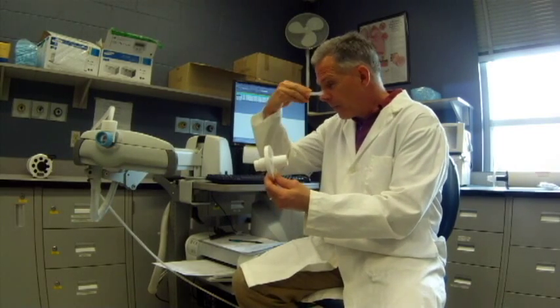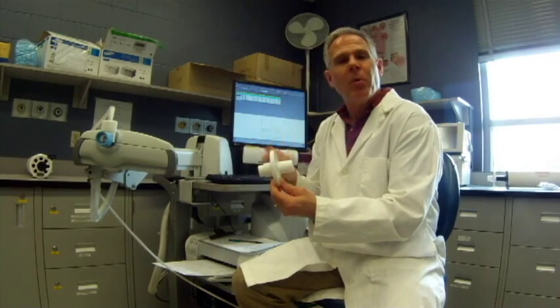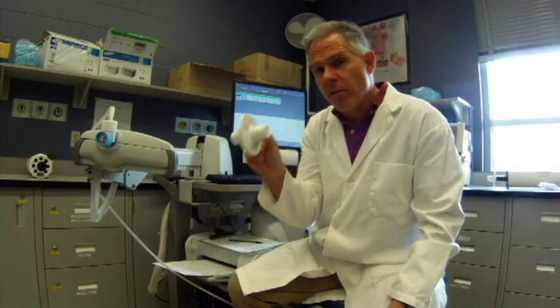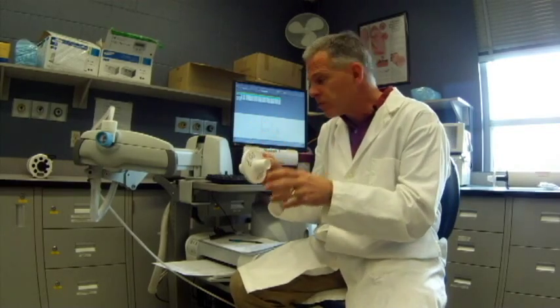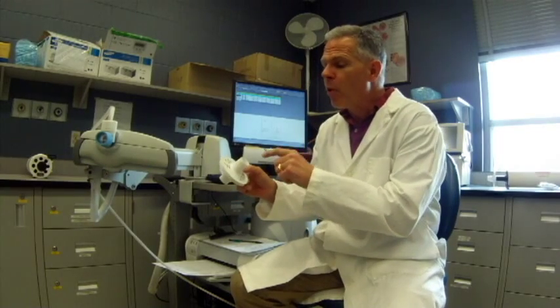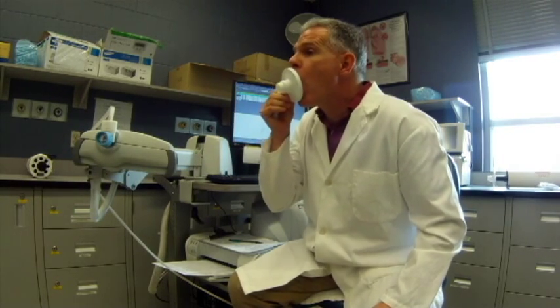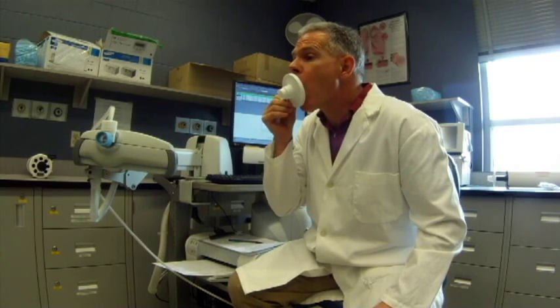It's important to get a good seal. We'll put on nose clips, and the patient will wear them for the test. We want their teeth on the outside of the filter and a good seal around it with their lips. If they're having problems, there are other mouthpiece options that can help. It's really important that they understand not to block the airway with their tongue — keep that clear, keep teeth on the outside, and get a good seal with the filter.